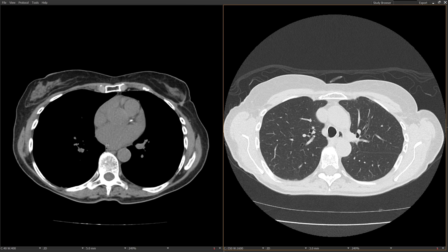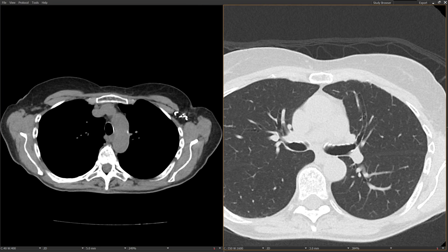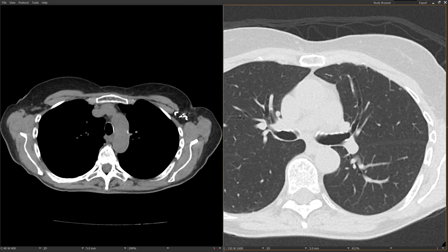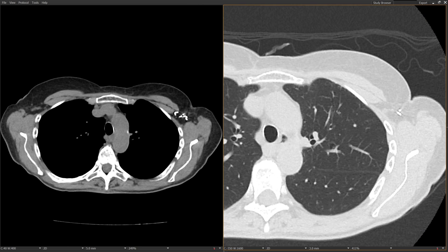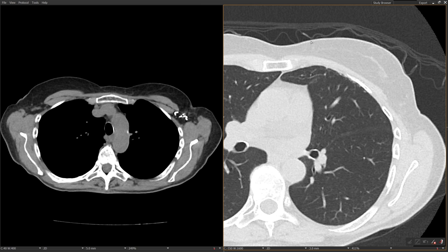On the chest CT soft tissue windows, you'll see that this patient has a small scar in the left breast from the lumpectomy, and clips in the left axilla. On the lung windows, there's a little bit of radiation fibrosis in the subpleural part of the anterior left upper lobe — mild reticulation and traction bronchiectasis. This is because the radiation field includes a little bit of the left lung just deep to the breast, so it catches a portion of the lung while covering the entire breast.